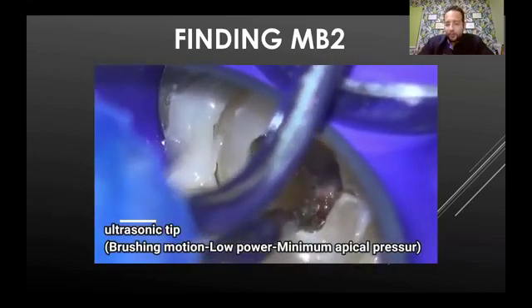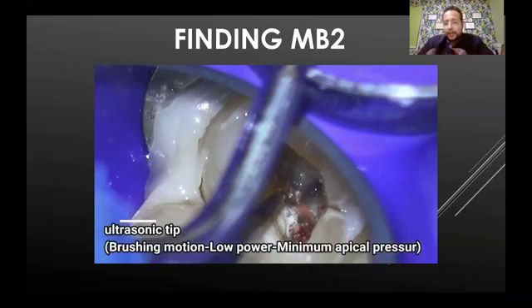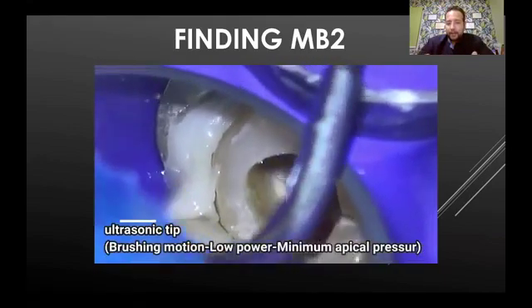Of course, as you see here, the advantage of ultrasonic over using burrs or stones is that the contra angle head will block your vision. On the contrary, with the ultrasonic you have a clear vision. Also, it's really hard to control your pressure using rotary. We use it, of course, without water, so still we can see what we are doing. And if the debris is accumulating very fast, you can wash and dry and irrigate and dry and start looking again.